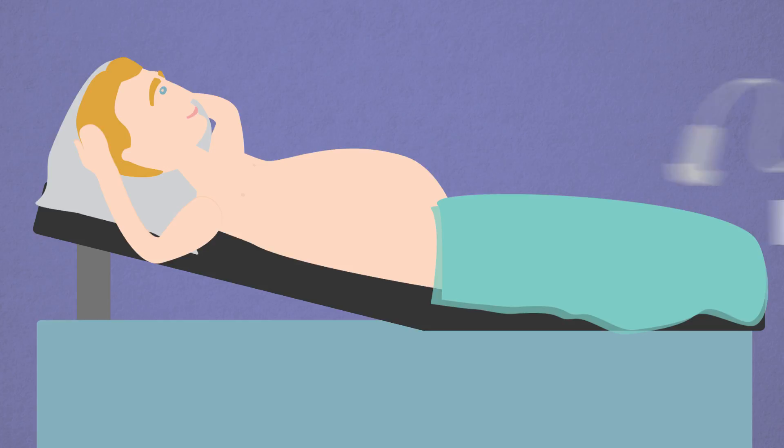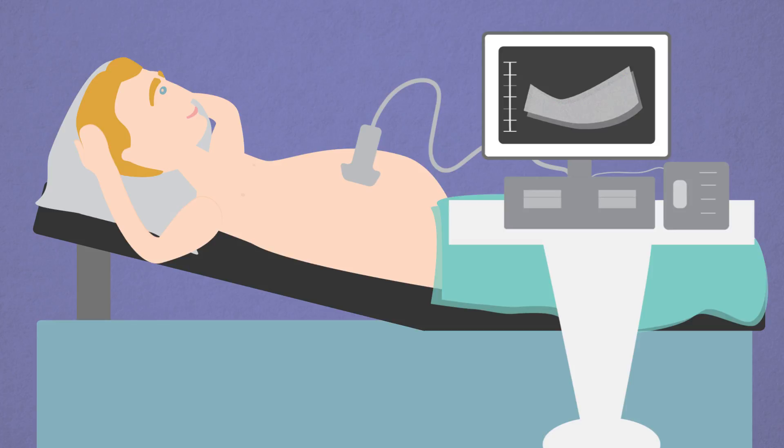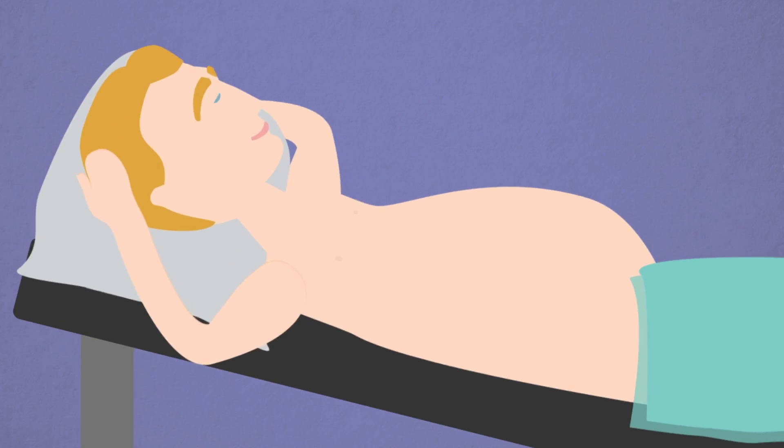After positioning, the doctor will sometimes use an ultrasound machine to help choose the safest location to insert the needle. The doctor will wash your abdomen with a powerful soap.